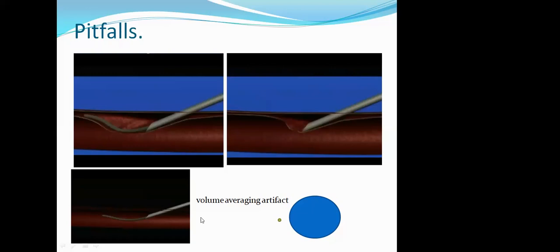Another pitfall is that sometimes when the person puts the needle in the vein, on the monitor you will see that the needle is inside the vein. But if you turn the probe to a transverse direction, you will see that the vein is here and the needle is adjacent to the vein.